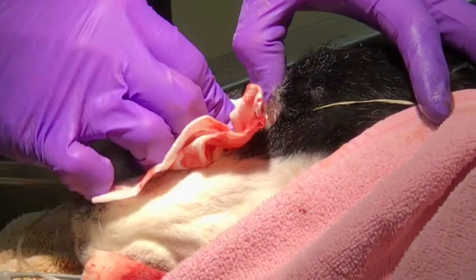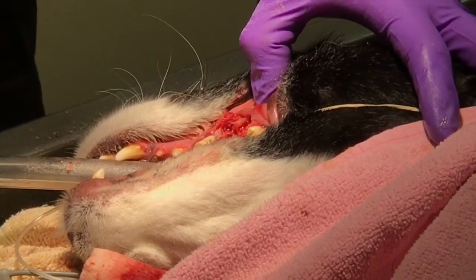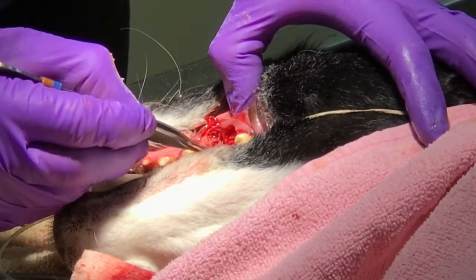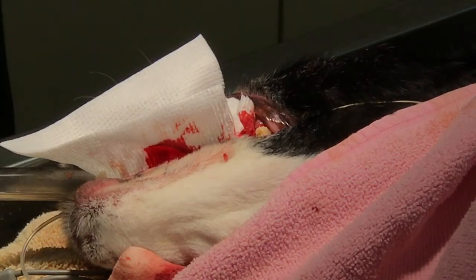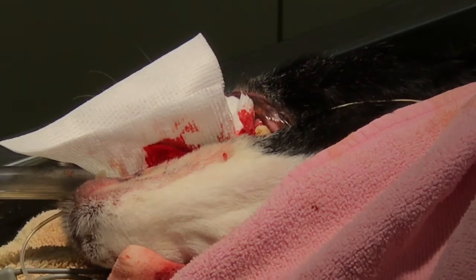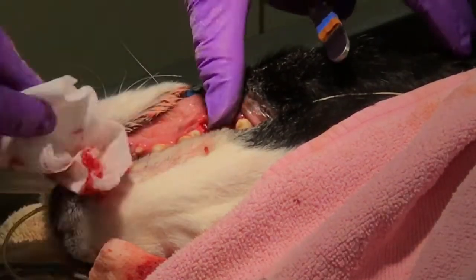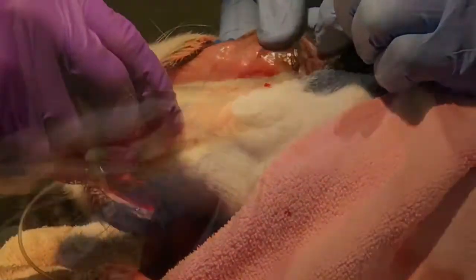So sometimes it can be simple to get these guys closed, and other times it can be a little more challenging. I think we might be lucky today. So we're now down to the last component. Again, just closing this extraction site. It's important to have a good closure so that any kind of food material cannot get up into these holes where the roots were located.